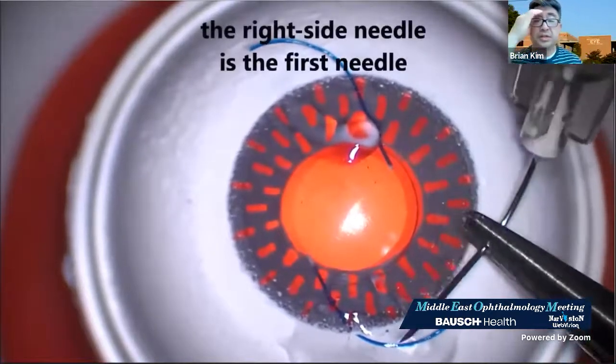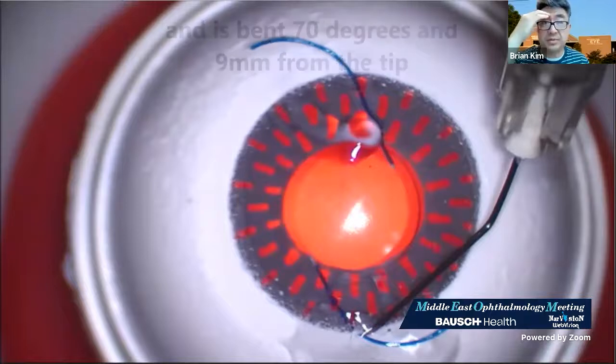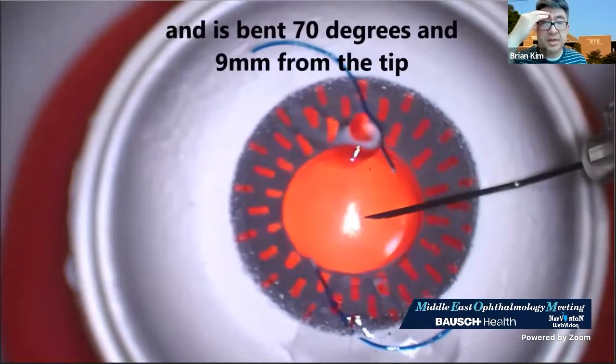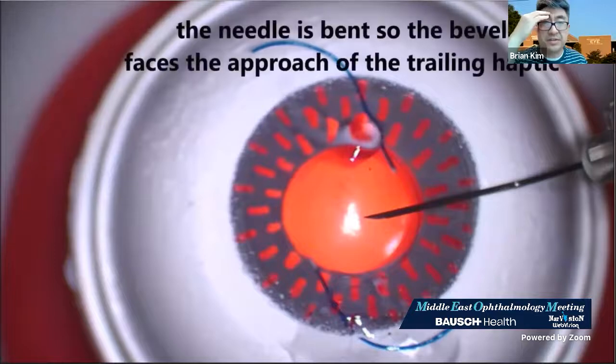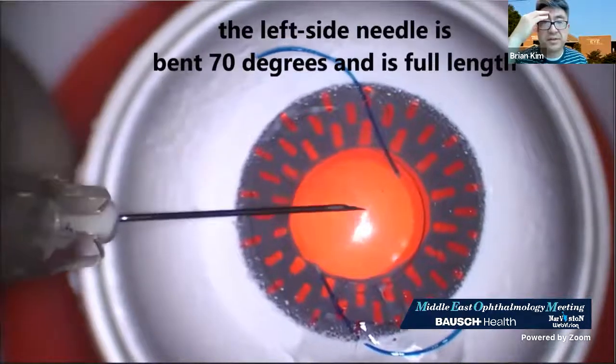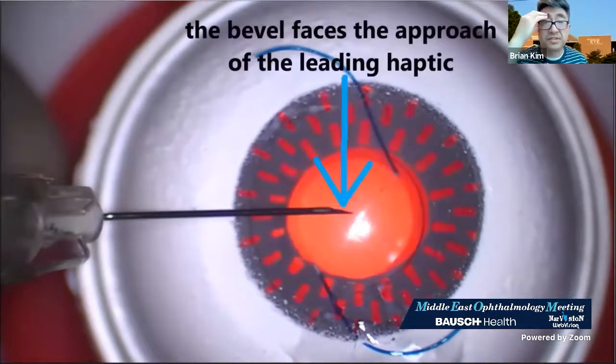And so again, illustrating the bending. The right side needle is the first needle, and it's bent 70 degrees, 9 millimeters from the tip. And you see the bevel is facing towards the approach of the trailing haptic. The left side needle is bent 70 degrees and full length, and the bevel faces the approach of the leading haptic.